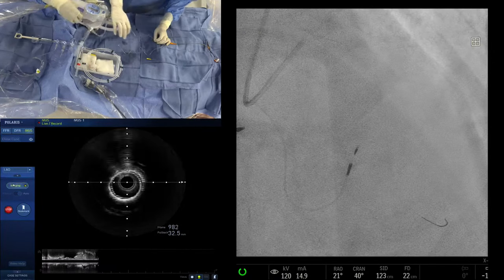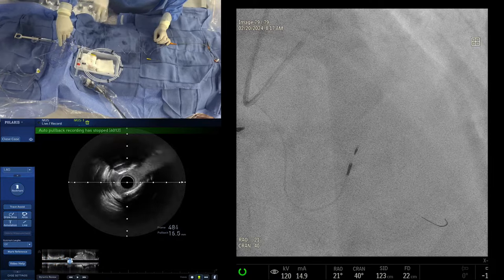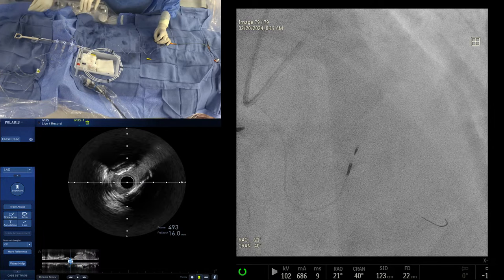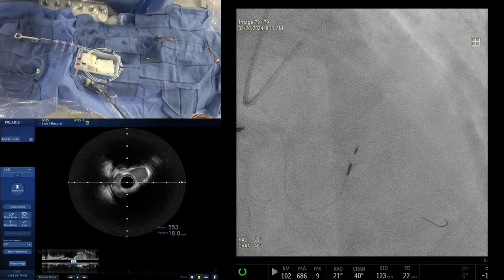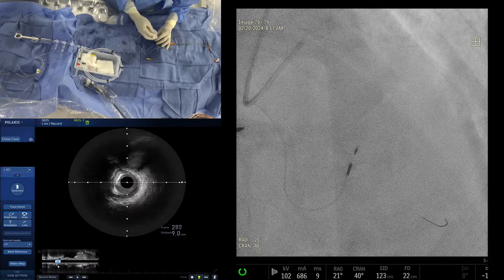Okay. So from your point of view, the area of maximum calcification, is it more than 2 arc, 180, or less than 2 arc in any area of that? Looks like here is more severe calcium. Is it 3, 1, 4? To 2 quadrant. I'm sorry, how much? 2, like 180. Okay. Not 3, not 270. Okay. So this is something which can do a cutting balloon, or you want to use an IVL?